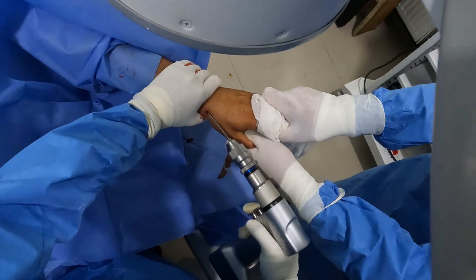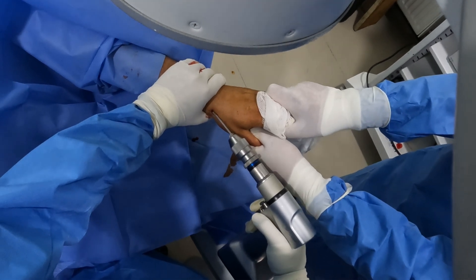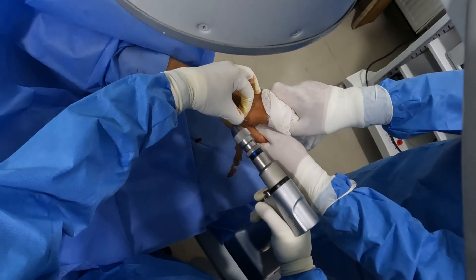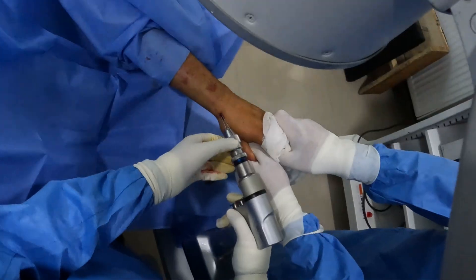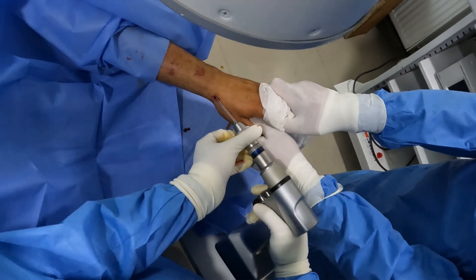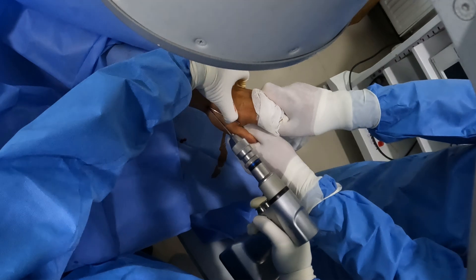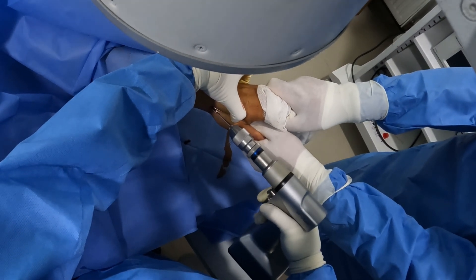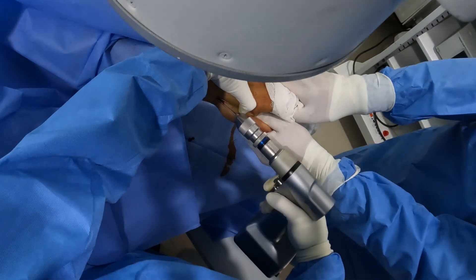I'll go through the radial styloid again and repeat the procedure. I'm just lifting the previously placed K-wire and readjusting the position of my drill so that I engage it at the volar side. Once the second cortex has been pierced, I'll confirm the position.